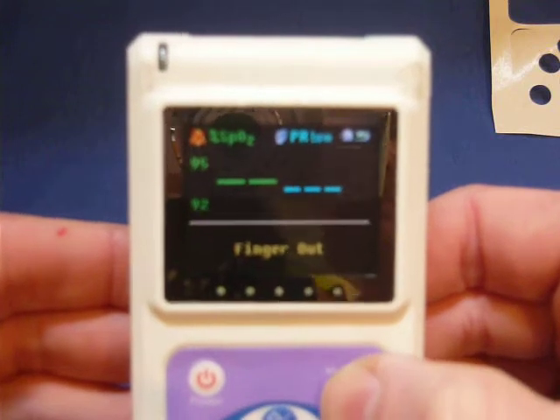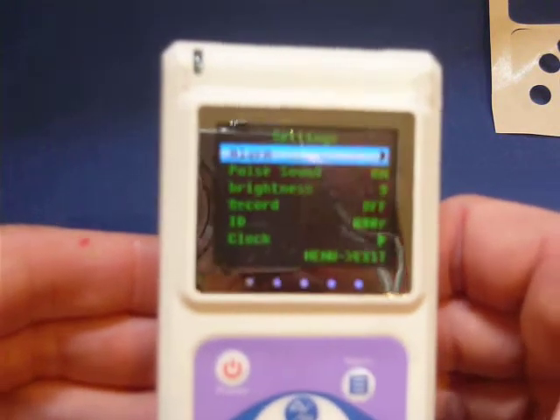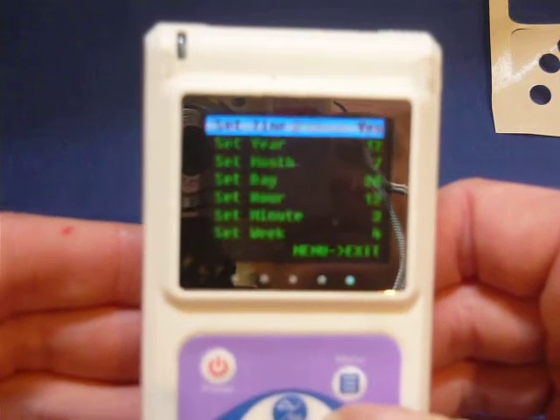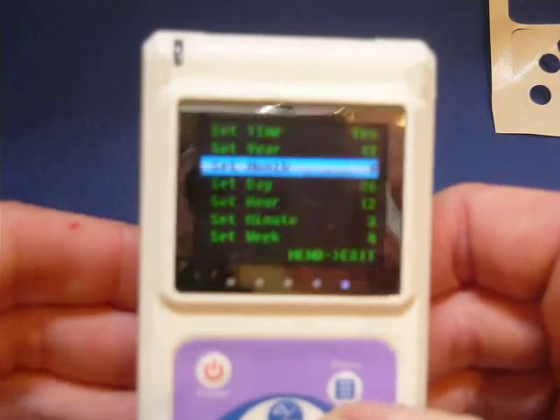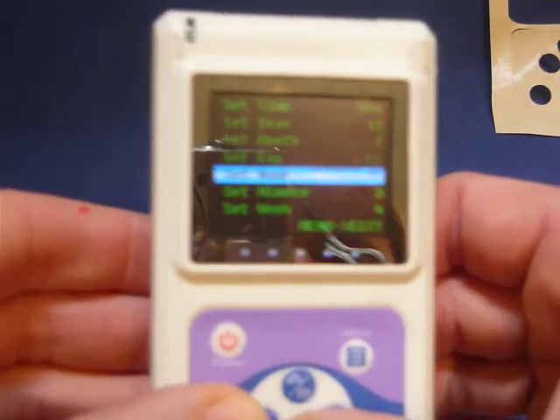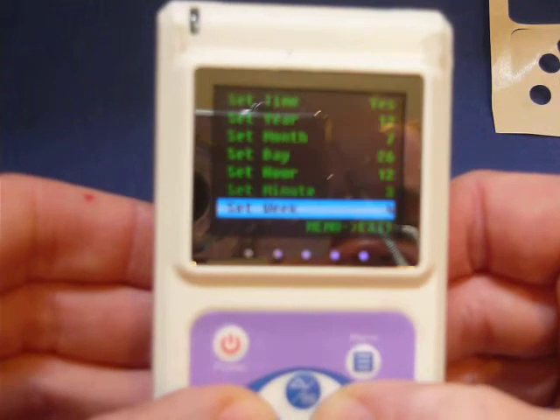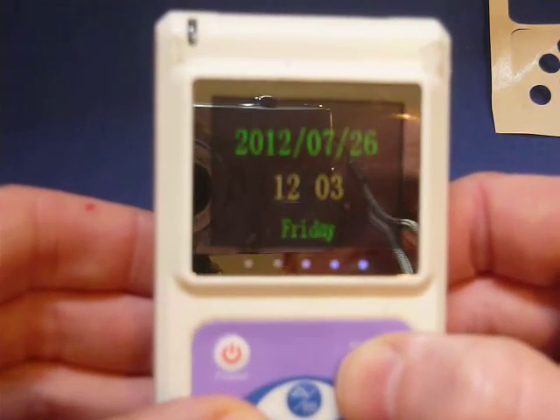Press menu to change the settings. Let's adjust the clock. Press down a few times and then right to select the clock. Press right to change set time to yes, and then each time setting can be changed. Right for up and left for down. Set week sets the weekday to 1 for Monday and 5 for Friday. Press menu again to save and menu again to return to normal.